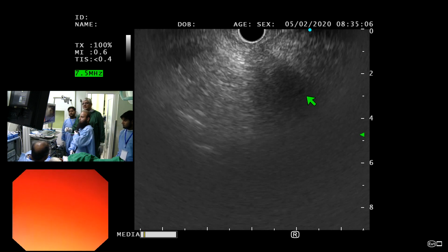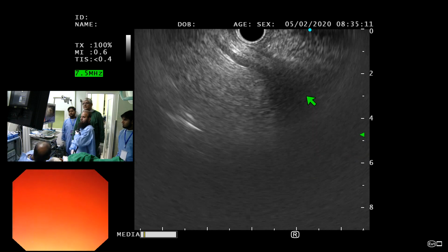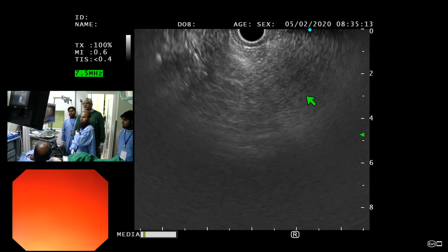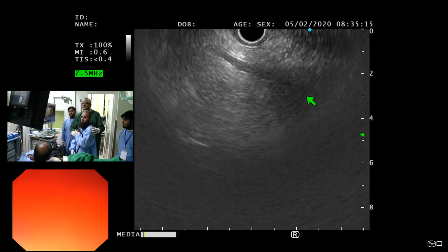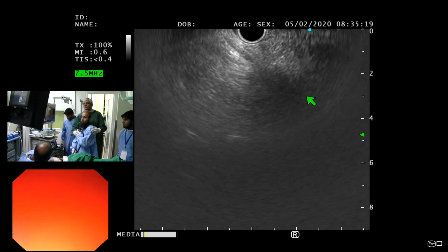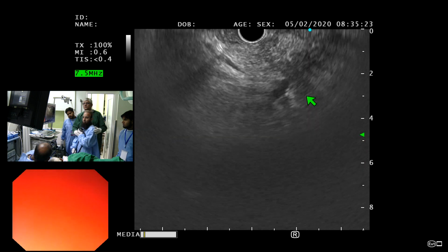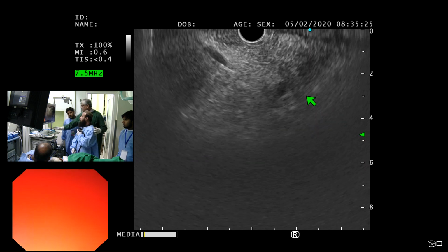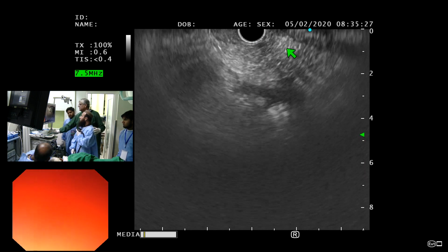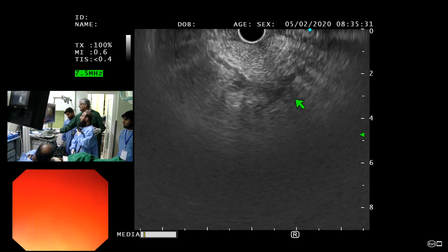If you tip down, then the other things change a bit. Now pull back, and pull back slowly. Slowly pull back, and keep doing clockwise, anti-clock gentle movement. Okay, pull back, pull back, pull back a little. Okay, that's your uncinate, okay? Which one? This whole thing is uncinate, okay? Right. Okay? And now the superior mesenteric vessels will be here, right?